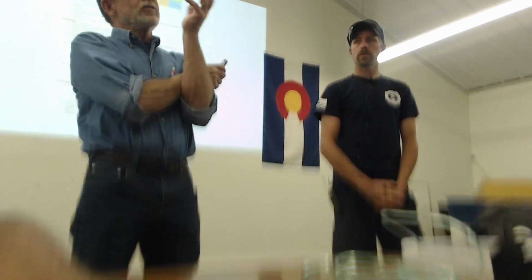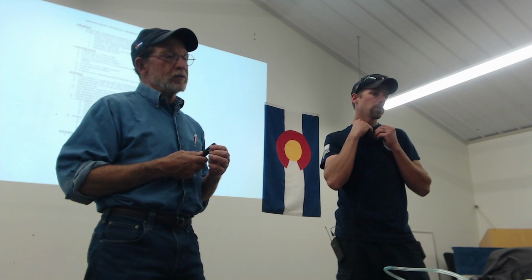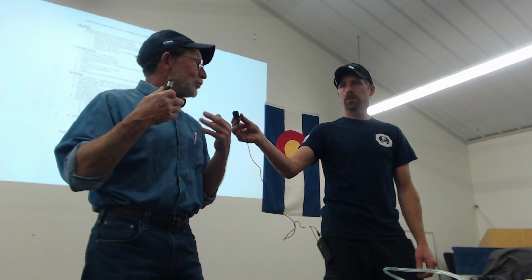CPAP is really for helping individuals whose pulmonary pathology is primarily obstructive. Obstructive meaning that these airways are collapsing or shrinking down. And of course, asthmatics know that that's one of the main things that happens to them: their airways are shrinking down because of spasm. But COPD, both chronic bronchitis and emphysema, that's the underlying pathology. Congestive heart failure with pulmonary edema because of the CHF is the other one where you're going to use it. So virtually any of your older patients that have chronic cardiopulmonary conditions that are deteriorating, it's going to be helpful. That's not to say that one of those might not be a long-time chronic lung or a long-time congestive heart failure patient with a history of prior episodes of pulmonary edema.